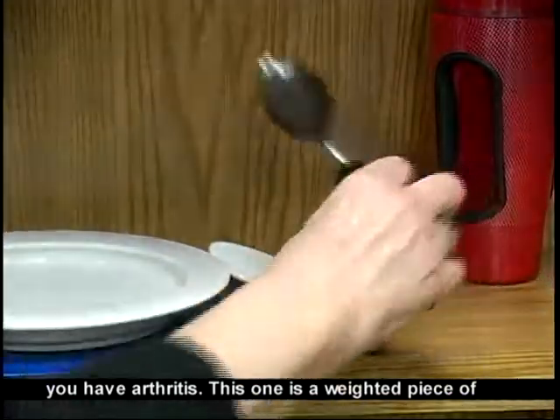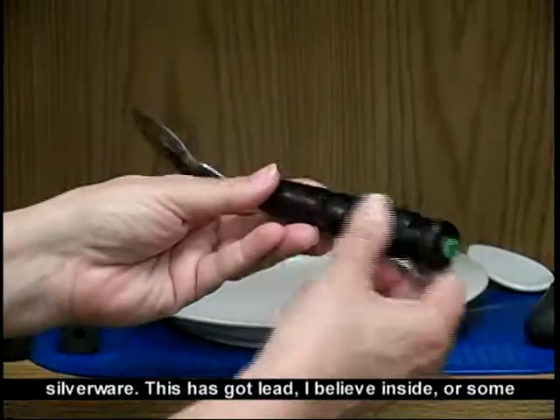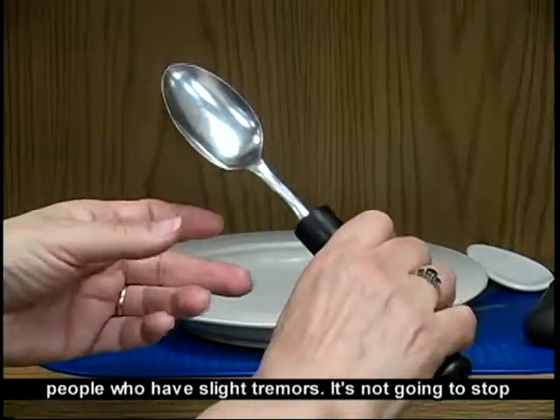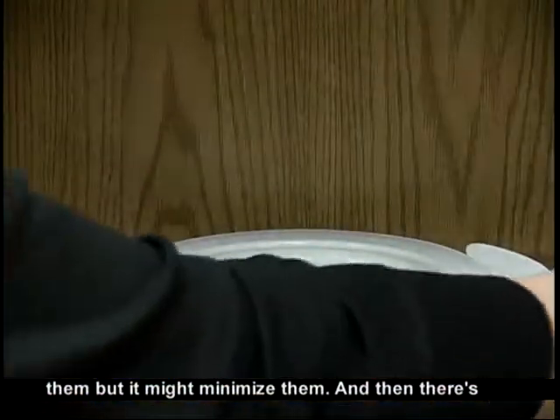This one is a weighted piece of silverware. This has got lead, I believe, inside or some kind of metal to give it a good weight to it. It's good for people who have slight tremors. It's not going to stop them, but it might minimize them.